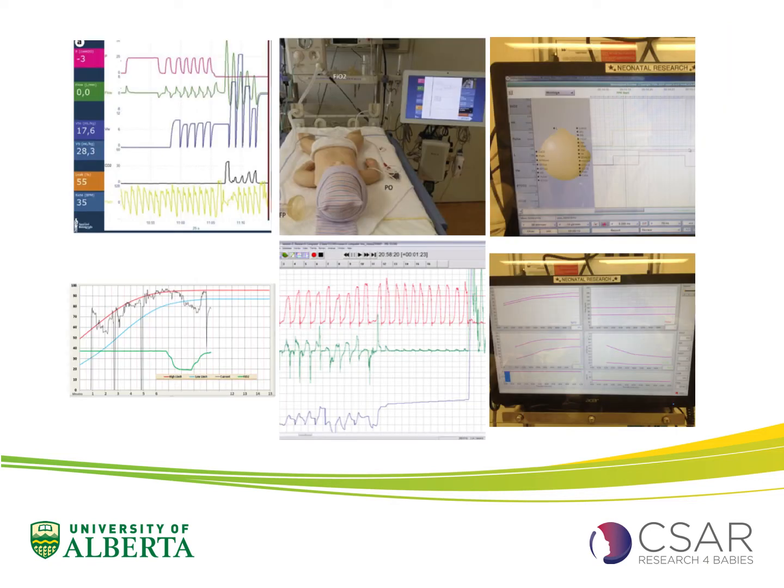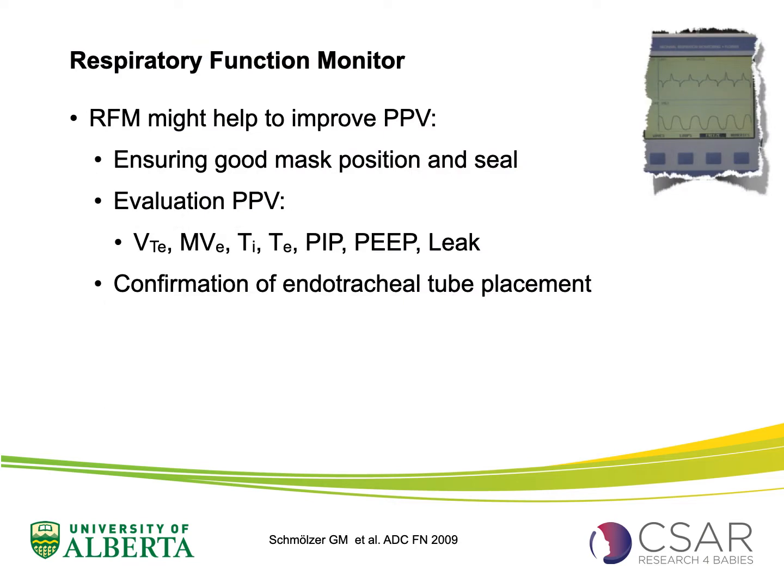Now, given that there is a great interest from a research perspective in respiratory function monitoring, there are several systems which have been developed to study respiratory function and how respiratory function monitors can be integrated into neonatal resuscitation. Now, how might a respiratory function monitor help?